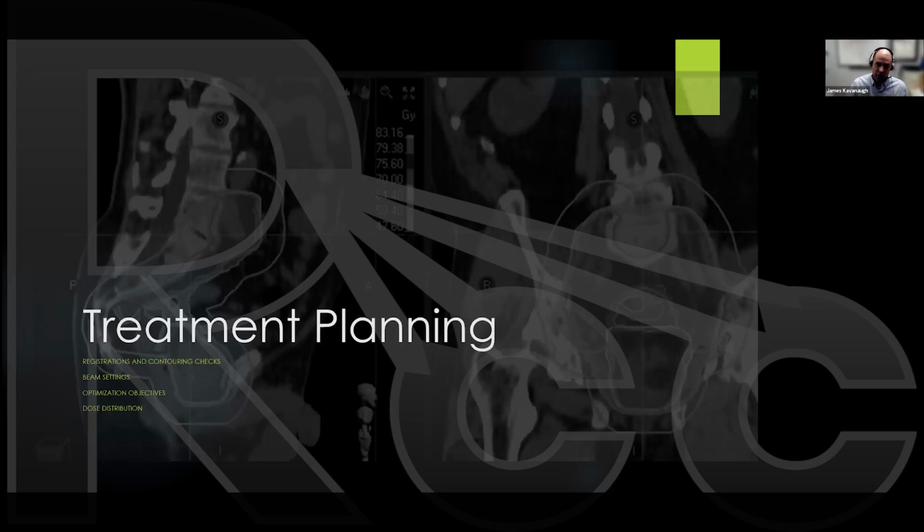Otherwise, we have those instructions even for conventional fractionation. Typically, the biggest challenge you run into, even with set instructions, is time of day of treatment. So they come in at 8 a.m. They typically have not consumed a bunch of fluid right before that, so there's not a lot of filling. At 5 p.m., they may have had lunch, they may have had a couple coffees, some water, and now that's all over the place. So our therapists also try to do a good job of looking at it and saying, "Oh, you're pretty full. Can you let out half? Can you just let out a little bit?" And then it makes their job a lot harder.